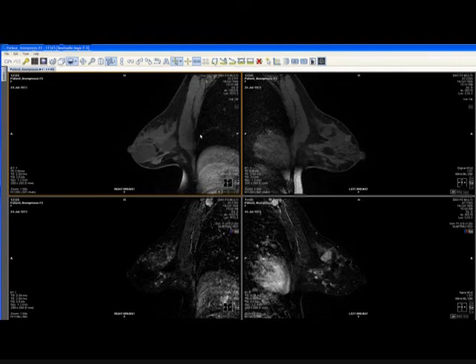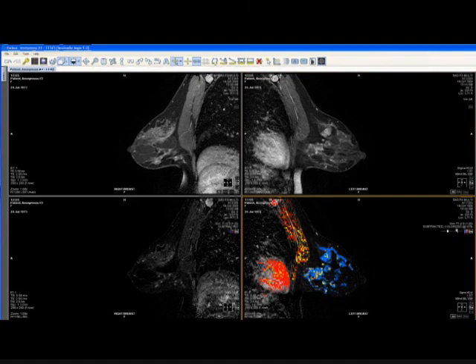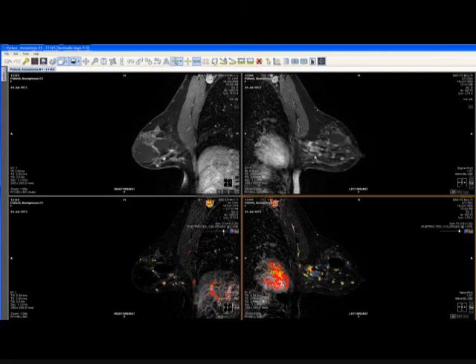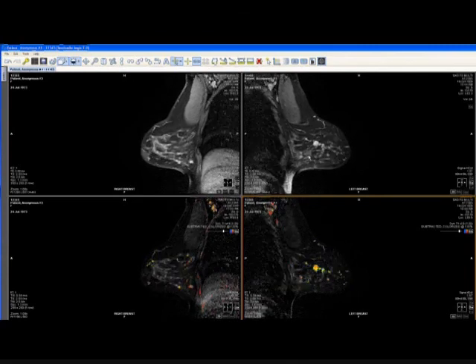As we go back then to the actual slice information, I won't go through my organized approach, just trying to get more cases reviewed here as we go from the pre to post contrast. Looking at these, the lesions, although several of them were larger, there are multiple of them. They're bilaterally located. We'll change the enhancement threshold a little bit here just to decrease some of the background noise, trying to find a more dominant lesion. But as we pan through, they're fairly uniform, but it's not just micronodular. These aren't foci. There's actually scattered macronodular enhancements you can see. But in general, relatively uniform.